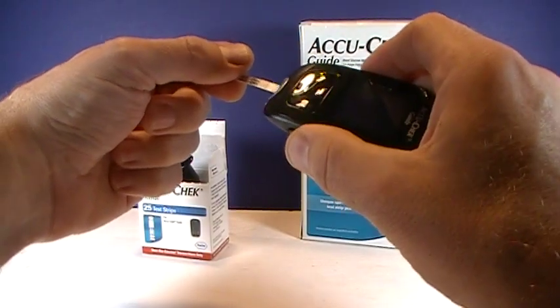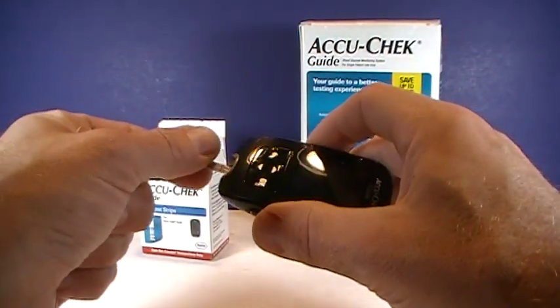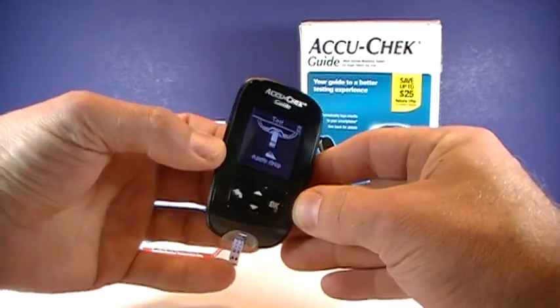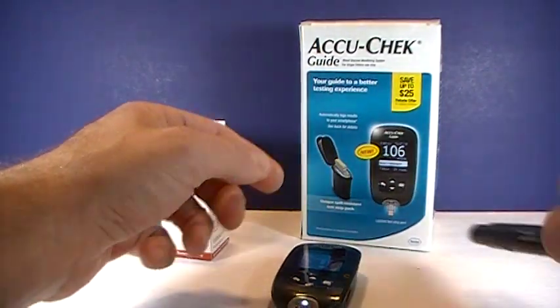You just go ahead and put that silver, computery-looking end right into the meter. The meter is going to go ahead and come on, and now it's saying 'apply drop of blood.'